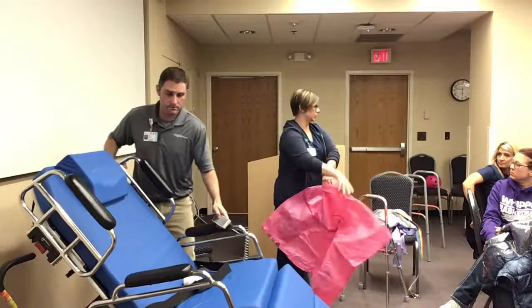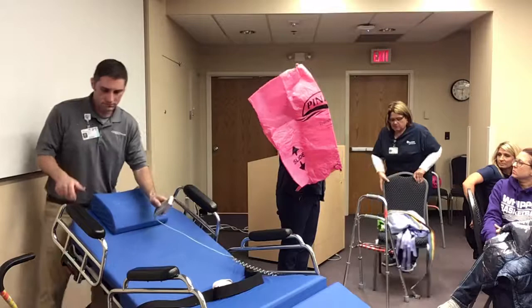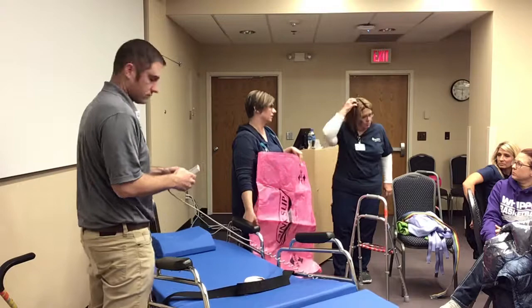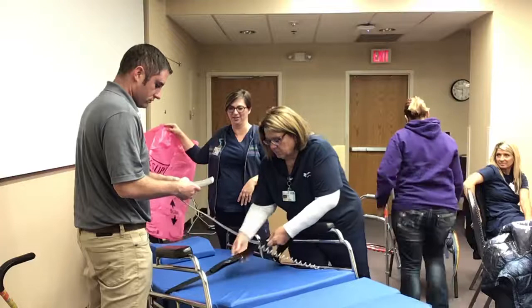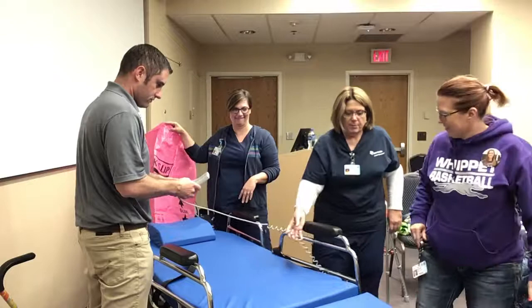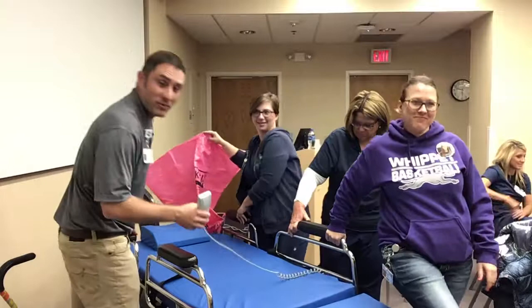Whichever direction you're going to move your patient, that's the way the arrows are going to go. So if you're boosting your patient, this slide sheet goes right underneath them. If the patient's able to, they can lift their knees up and just push themselves up. It's that simple to have your patient boosted.